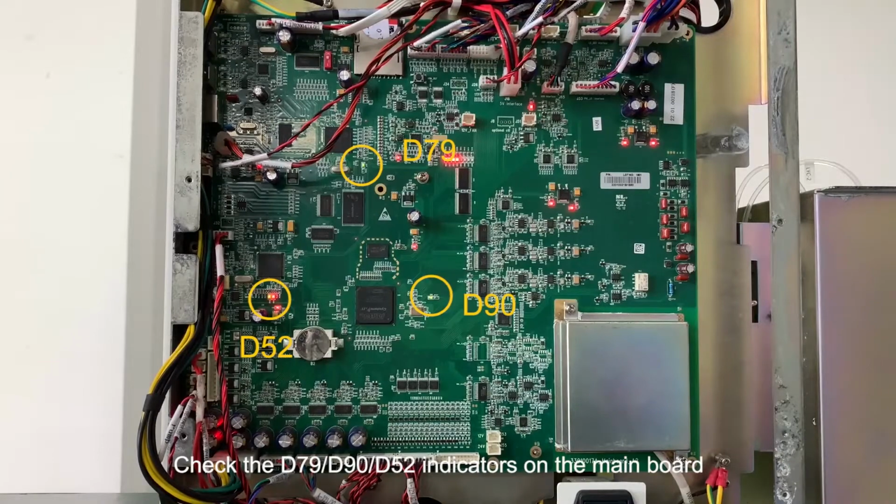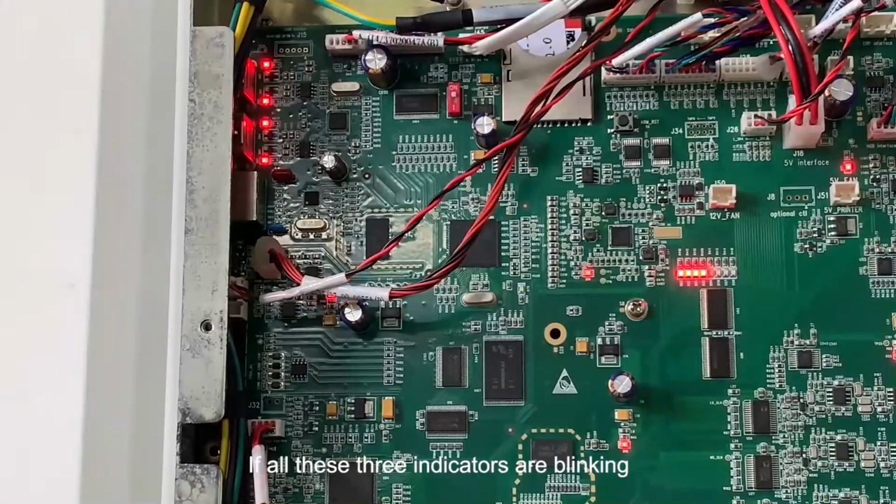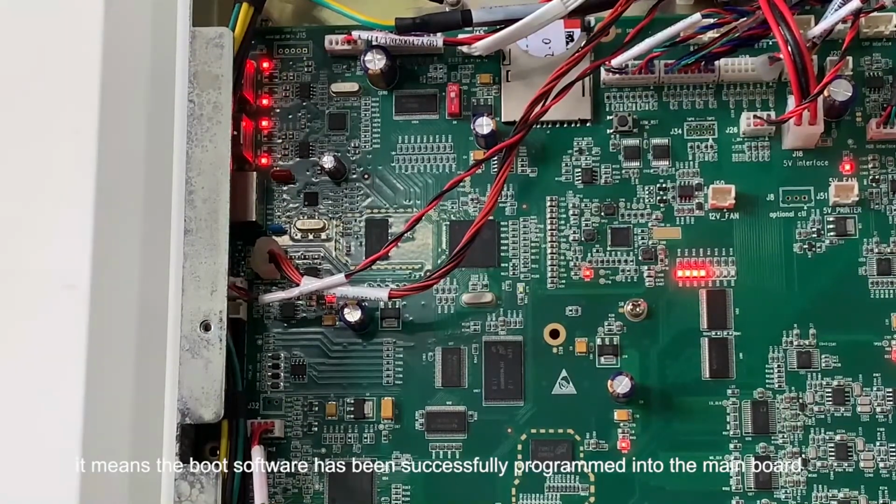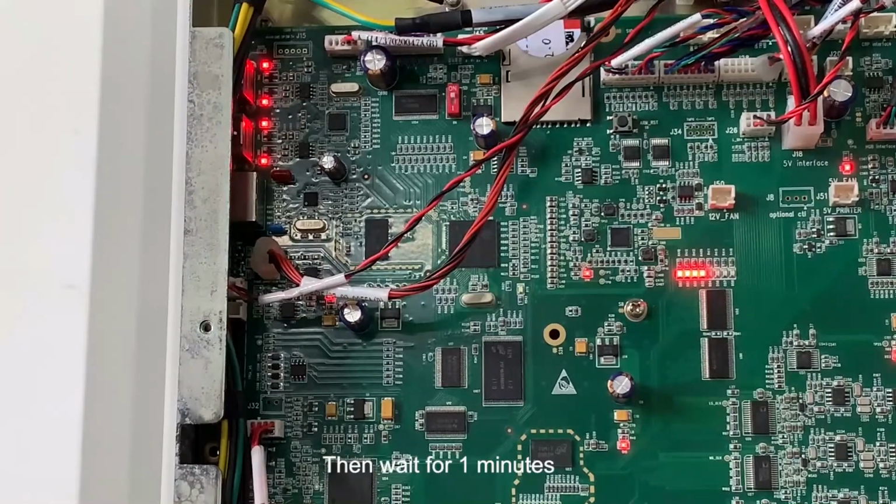Check the D79, D90, D52 indicators on the main board. If all these three indicators are blinking, and the four red lights in the upper left corner are on, it means the boot software has been successfully programmed into the main board. Then wait for 1 minute.